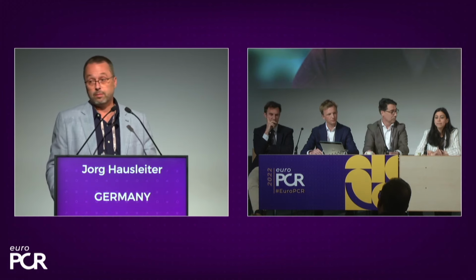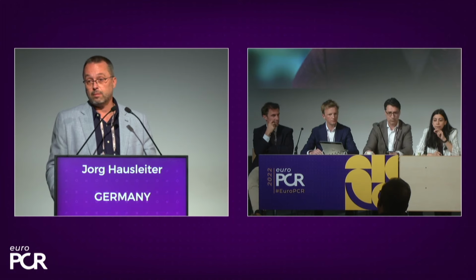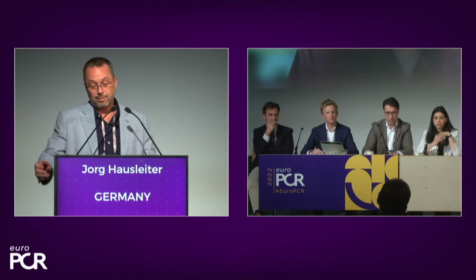Any comment on that, Susheel? I think in the end, it's going to take time to see these results. And I think in the end, it's about MR reduction. And I agree with Jorg that you got to get to 1+, especially as we treat lower risk patients, younger patients. We got to get to 1+, and that's fundamentally the issue. The rates of SLDA and all these things are really in anatomies that aren't ideal. Whether this device is better than the other in that regard, it's going to be hard to suss out, and we're going to have to understand which anatomies have theoretical advantages.